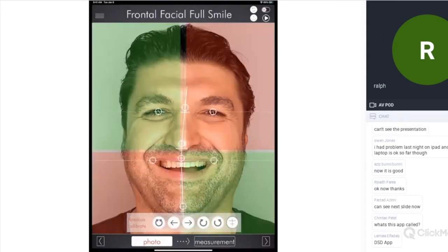Let me see my facial flow. That's my facial flow. I see my nose looks to the right side of my face, and my philtrum and chin go in the opposite direction. If my facial flow were like this, towards the right side, then my design should be towards the right side. Otherwise, we have tension in the face. Let's consider my occlusal plane. You see it goes towards the red side. So it's a visual tension. We don't want a design like this.